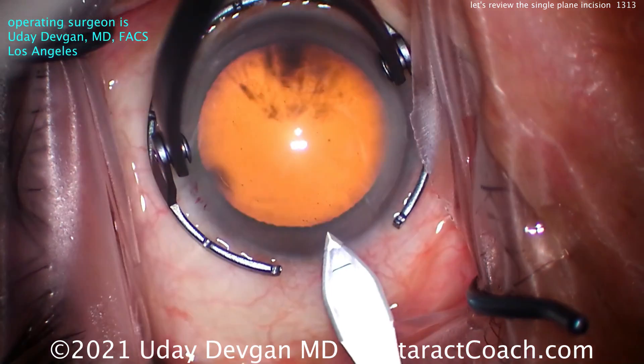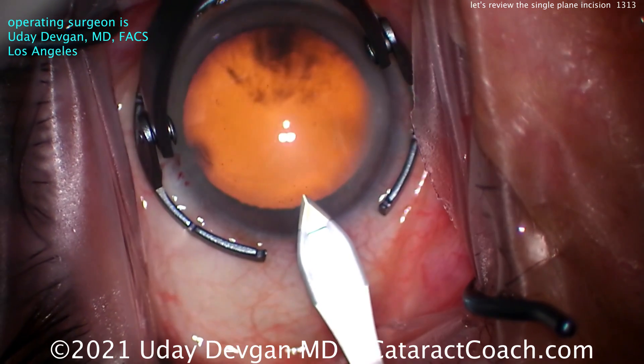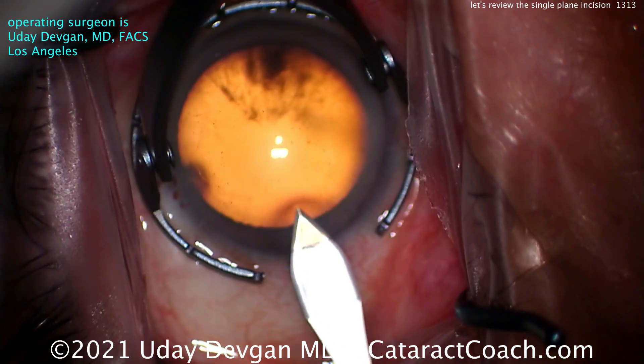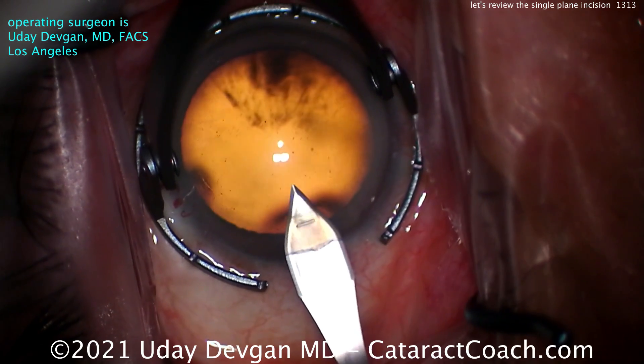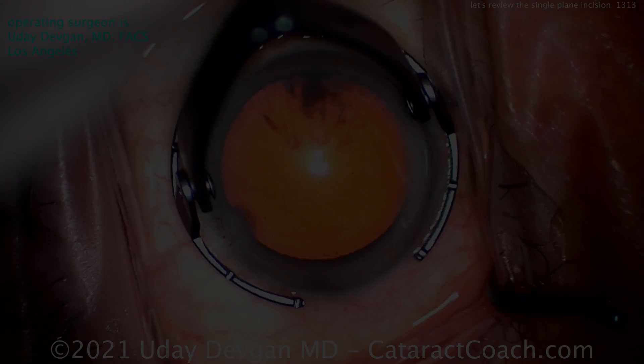Watch carefully. Starting in there, we make the incision a single plane and we enter the AC — nice and easy, just like that. Perfect!